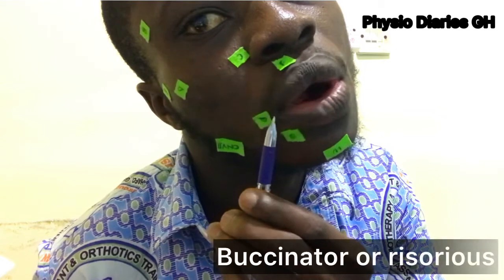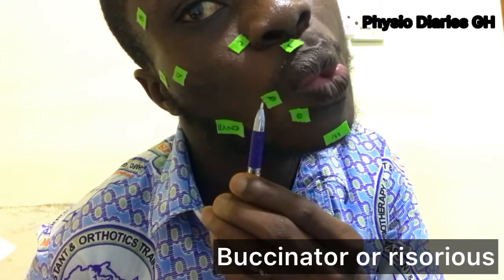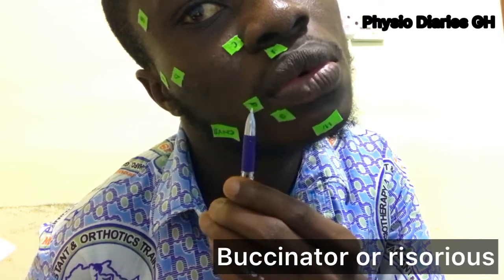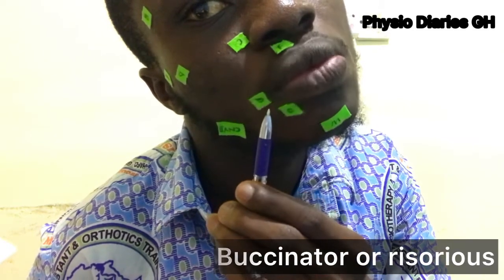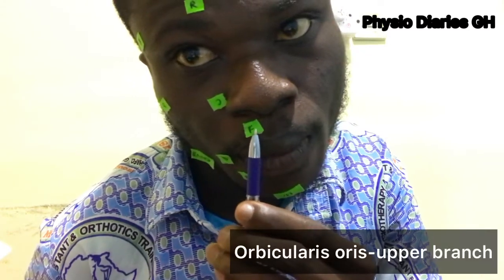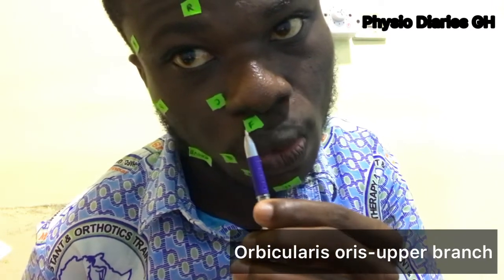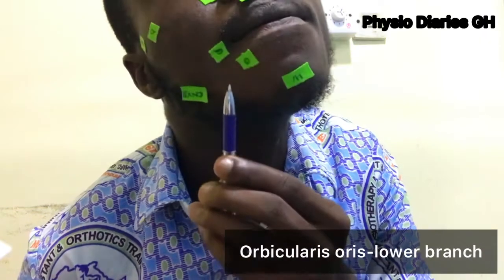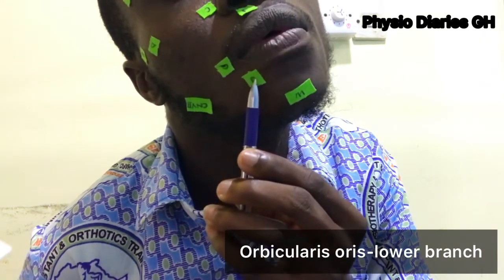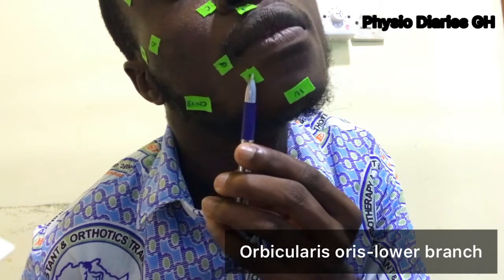The muscle marked P is called the buccinator or the risorius muscles. The buccinator holds the cheek to the teeth and assists in chewing. The muscle marked F is called orbicularis oris, the upper branch. The orbicularis oris helps in orofacial functions such as whistling, chewing, swallowing, sucking, vowel pronunciation, and kissing.